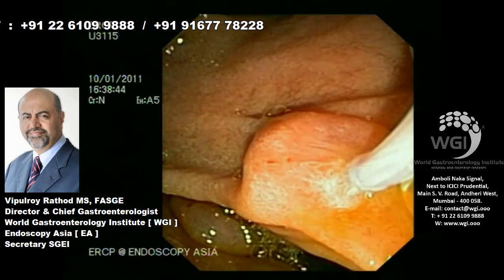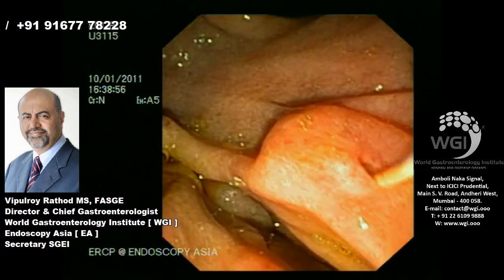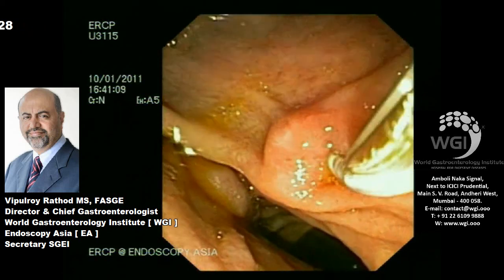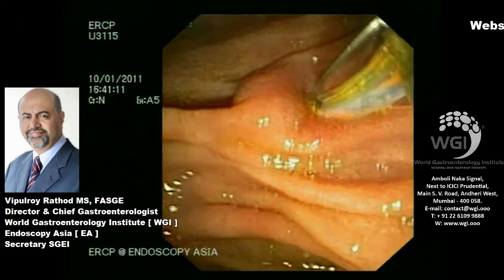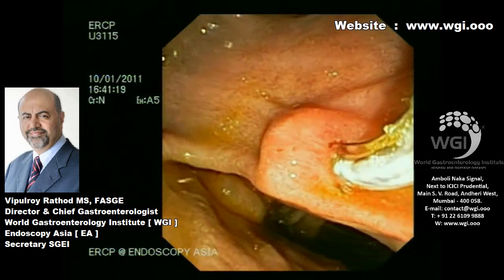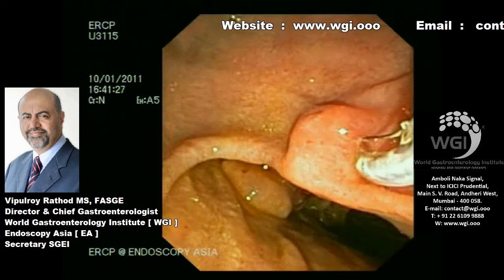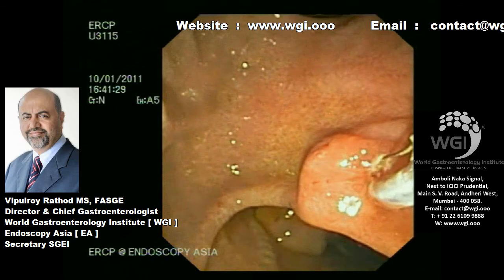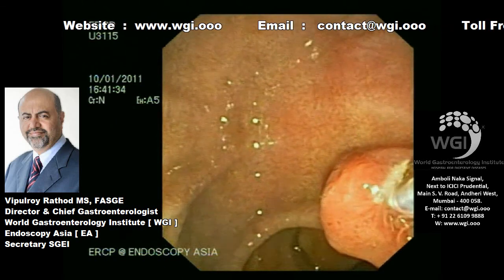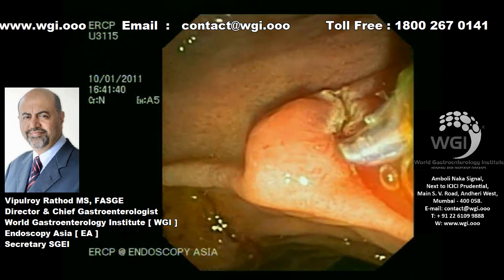We will proceed with a formal minor papilla sphincterotomy. As you can see, we have done the major papilla sphincterotomy, and we are now cannulating the minor papilla with a sphincterotome. In a very controlled manner, we perform minor papilla sphincterotomy — the vision should be clear. We use a very short burst of Endocut energy, the same setting I use for biliary sphincterotomy. The full minor papilla sphincterotomy is achieved.